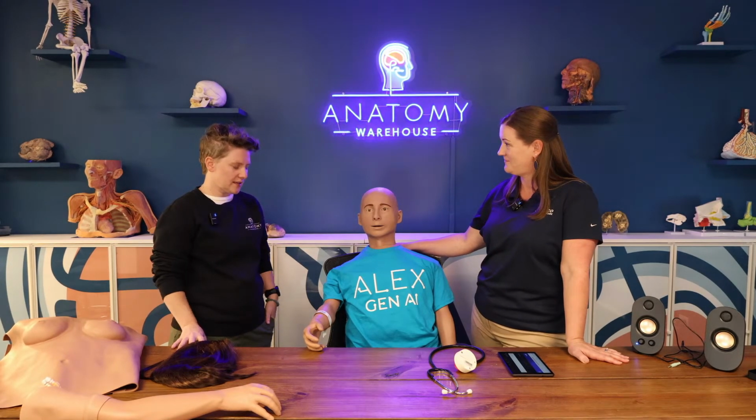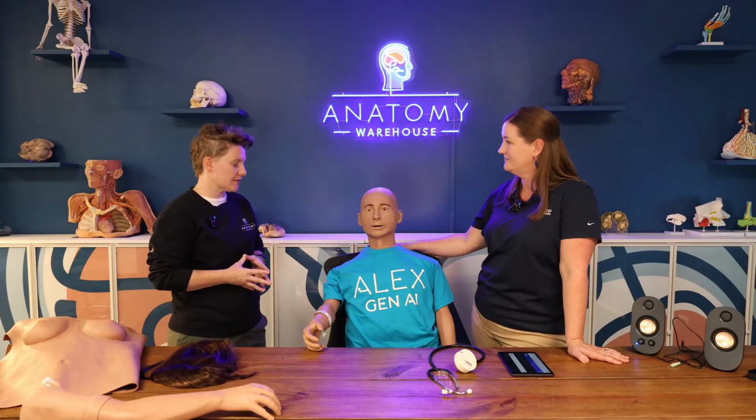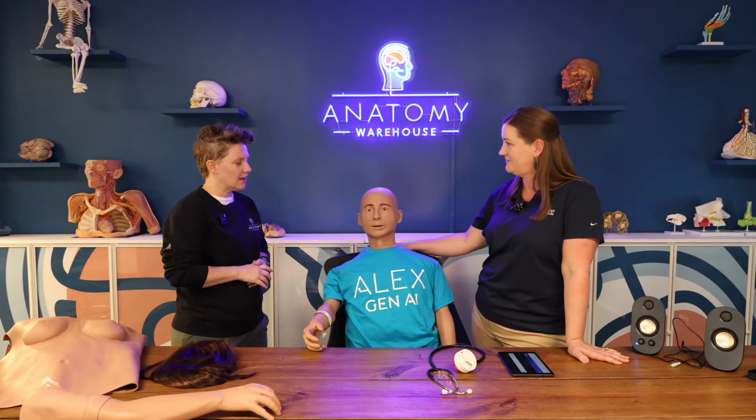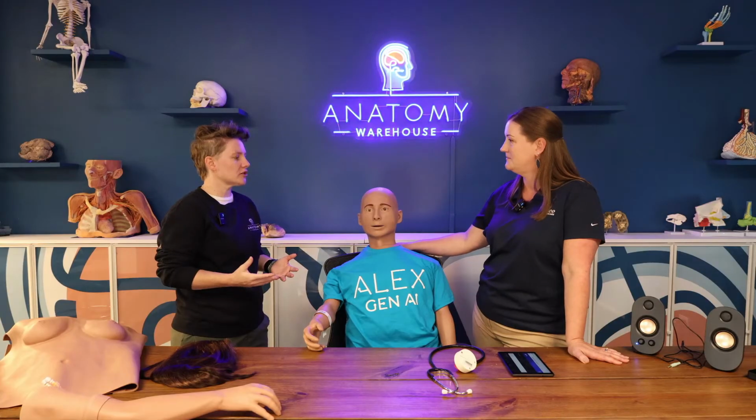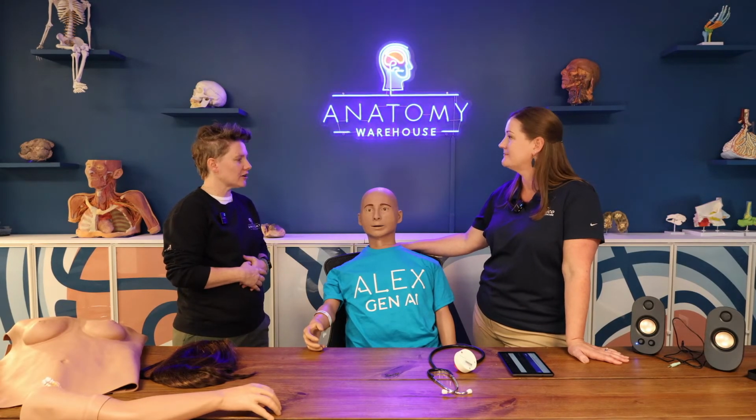Awesome. So it sounds like we've got a lot of really classic simulation opportunities on the physical side. You mentioned the intubation airway. That's always such a popular and asked for feature, especially in trauma scenarios.